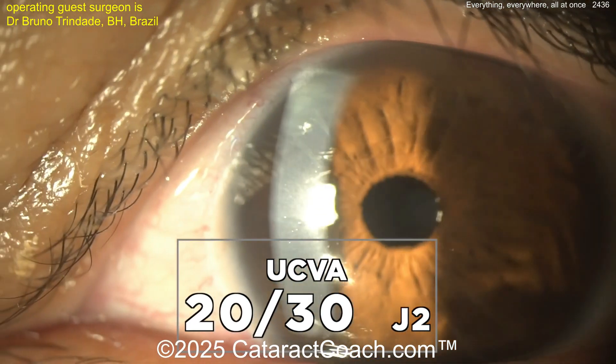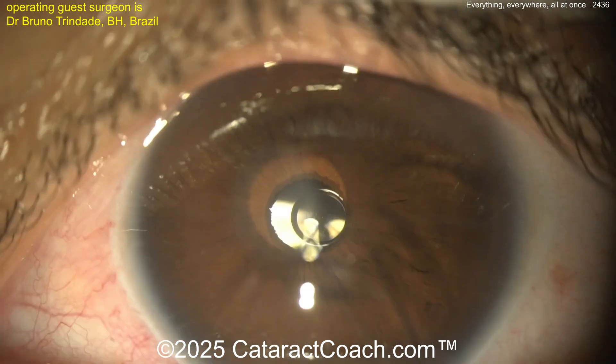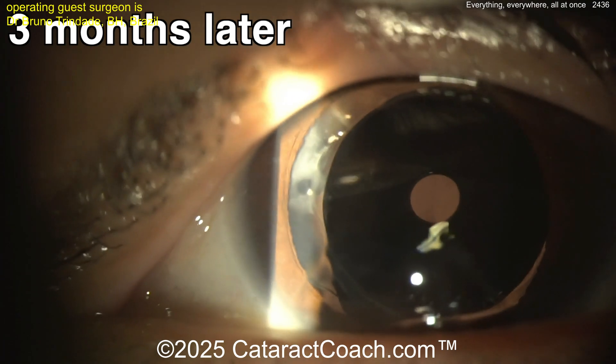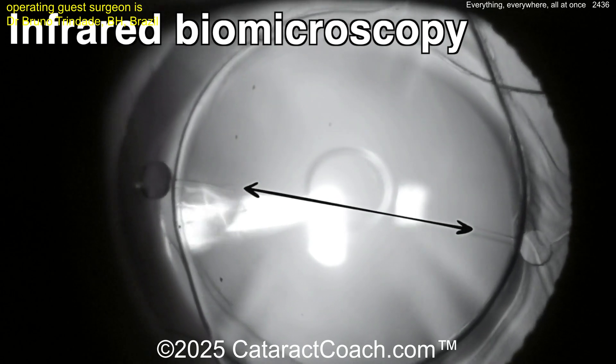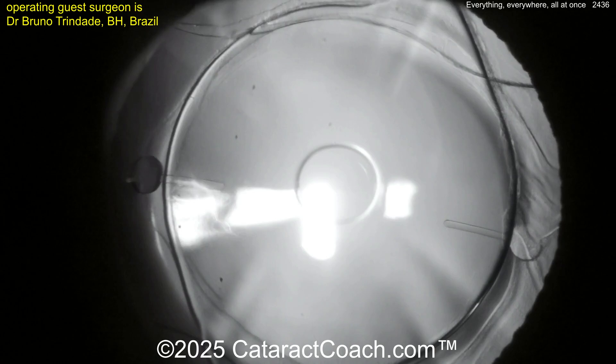Now you may be wondering how you can see back through that opaque pinhole — let me show you, this is the neat part. Patient vision is beautifully 20/30. There is the centered-up pinhole, and three months later everything looks fantastic. This pinhole is only opaque to visible light — infrared light can go right through it, so you can examine the retina, do an OCT scan, anything you want.